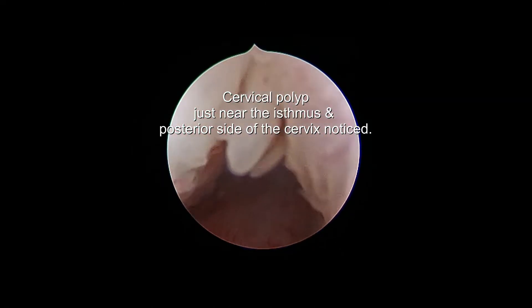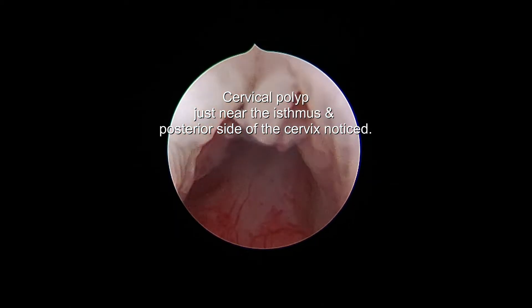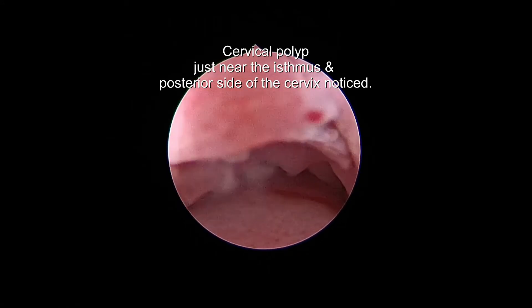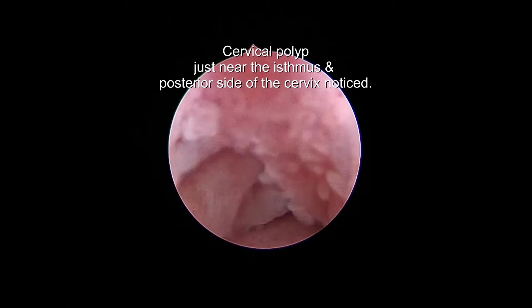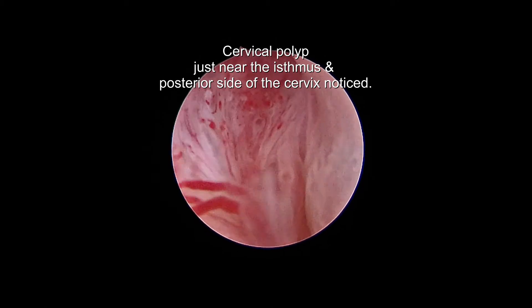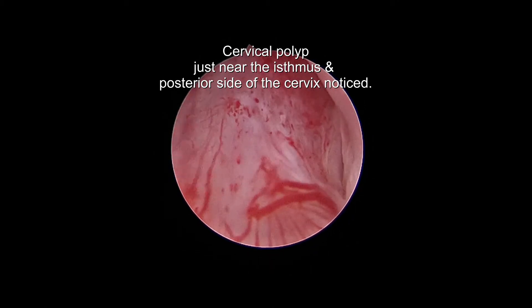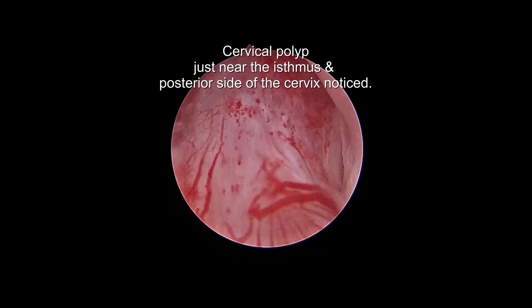Now here is where the polyp starts — this is the base. What people commonly do is try to remove it with a curette, ovum forceps, or Allis forceps, but that is not enough. Because if the base remains, there is likely to be recurrence.